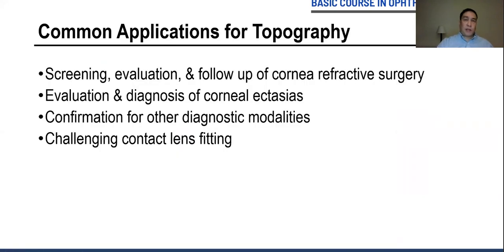So what are the common applications for topography? Number one, the screening, evaluation, and follow-up of corneal refractive surgery patients. So think about it. If over 30 or 40 million people have had LASIK or PRK, then 30 or 40 million people have had this kind of test already. Very, very useful. It's used also in the evaluation and diagnosis of corneal ectasia.